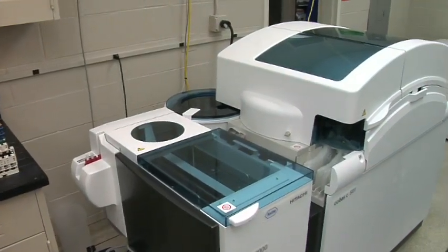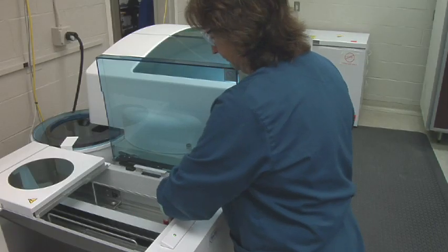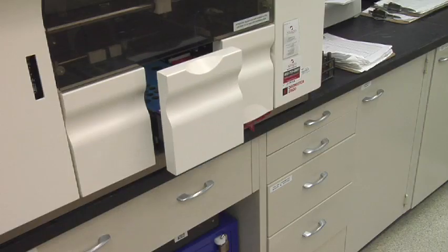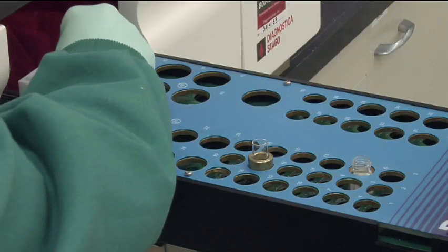By using specially calibrated equipment, diagnosticians are able to customize tests to fit the client's needs. We're able to say, okay, this is a dog, and these are the dog normal ranges. This is a cat, and these are the cat normal ranges, and all other species also. If you were to submit your samples to a human lab, they're not able to test specifically for your animal.